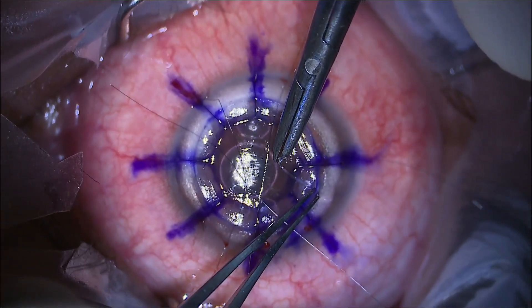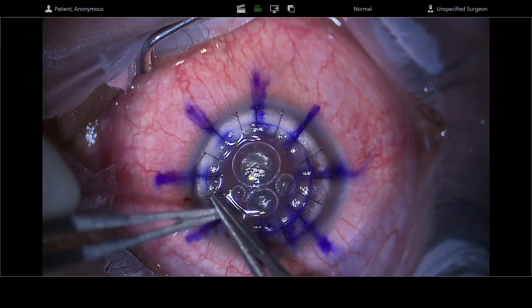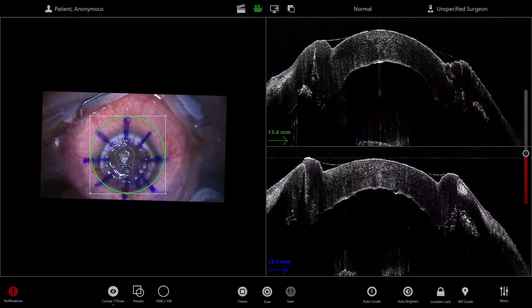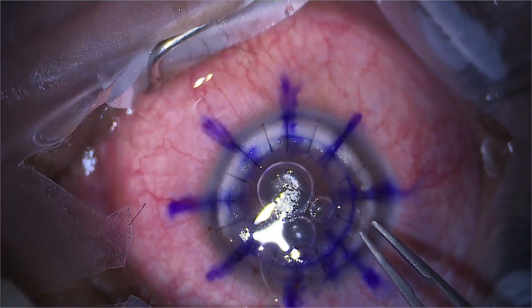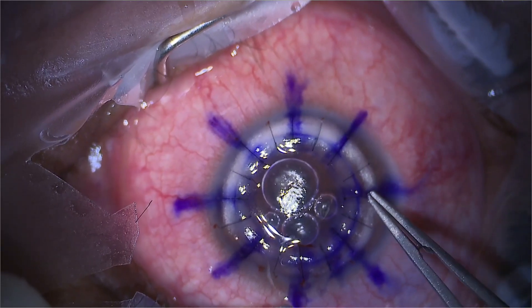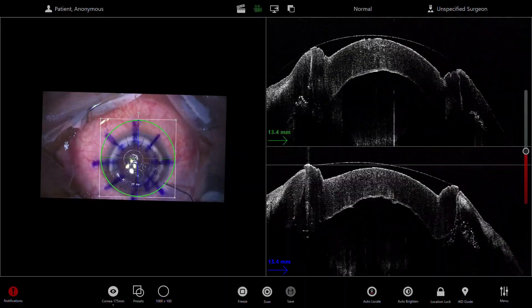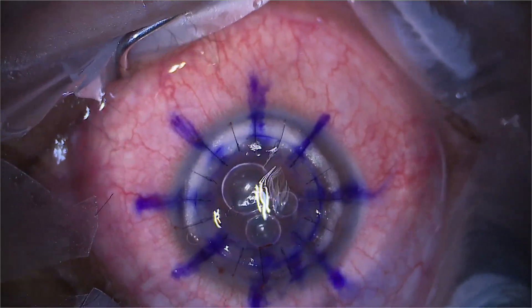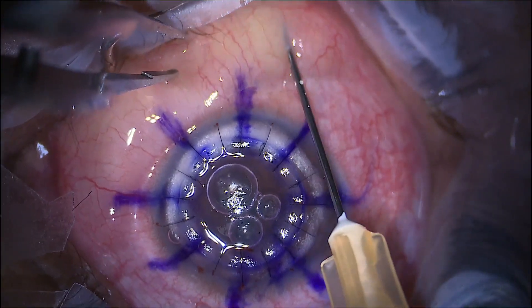Once you've put your 16 sutures in, occasionally you may need to check the edges at the interface — go around the edge between host and graft. I sometimes use a spear just to dip and check if there's any viscoelastic that's been squeezed out. The OCT is very useful to check that there's no double AC or trapped areas. Here I'm now burying all the sutures — I usually bury the knot on the donut and am very careful not to go all the way around through the interface and back out again. You want to bury it on the side that you're leaving it. Now I'm filling the AC, checking the pressure, putting the sub-conjunctival injection in, and we're done.